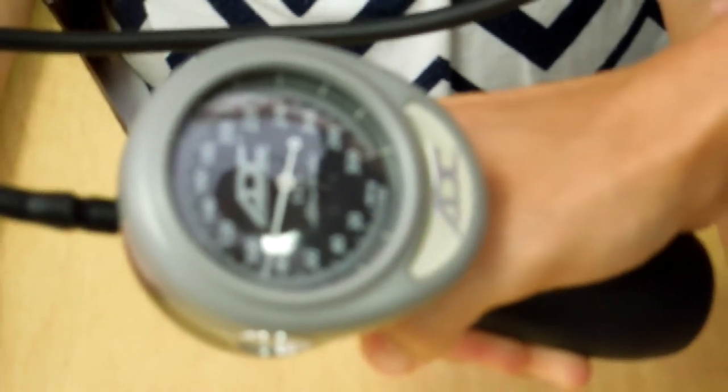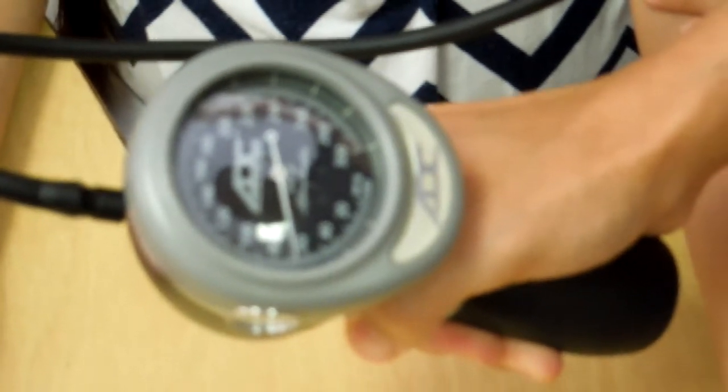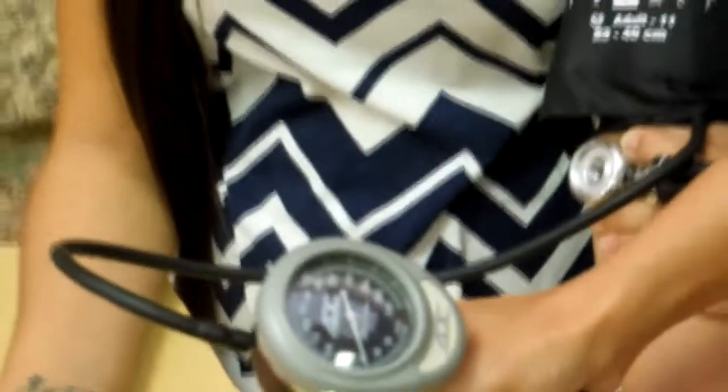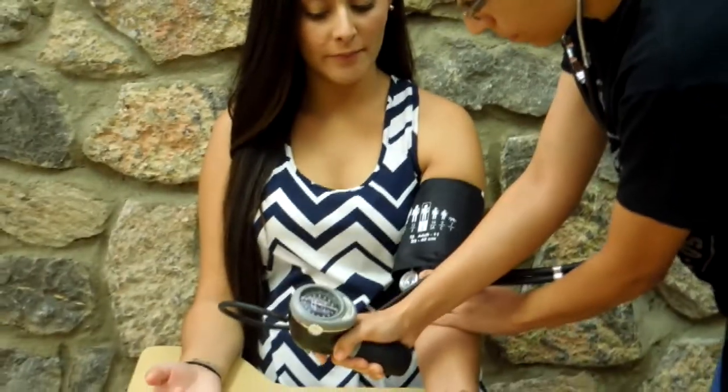Systolic blood pressure is the moment in which the initial two or more Korotkoff sounds are heard, also known as phase 1. The disappearance of the Korotkoff sound is the diastolic blood pressure, also known as phase 5.